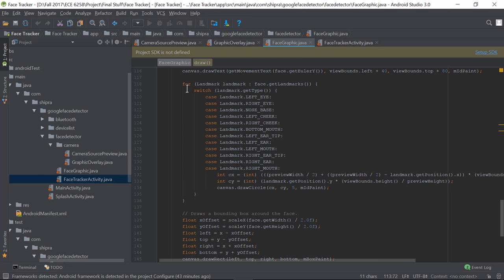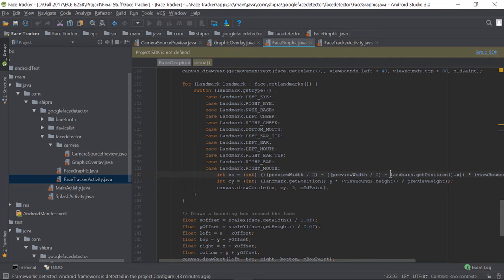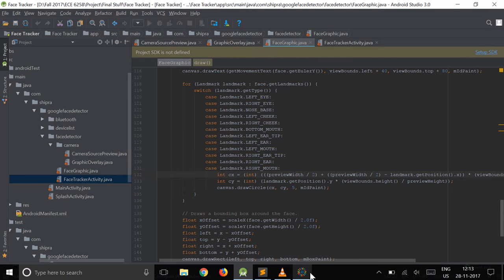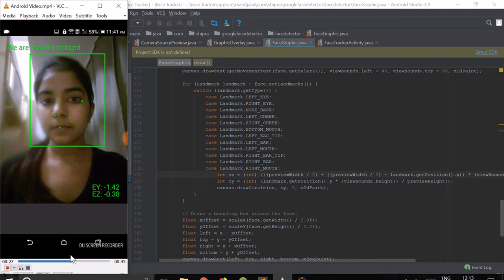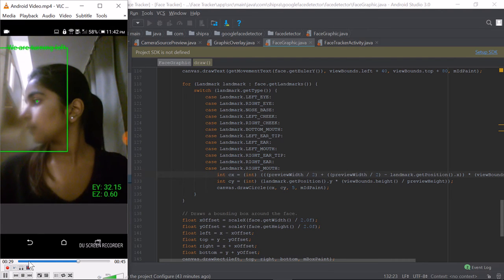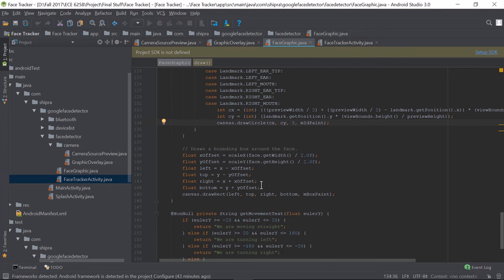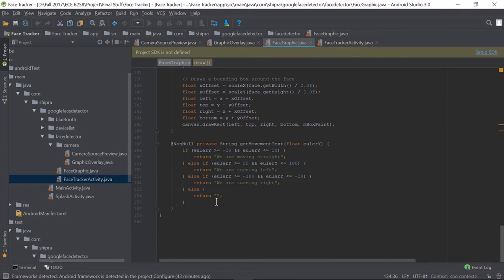This is how we are using the landmarking. We have devised these landmarking points, and then depending on the positions that we get here, we are able to get the various points. That is why it's a bit slow while it works, because once you move left and right, it tries to find the points and trace them, so it does take a little bit of time. And this is the definition of the bounding box.